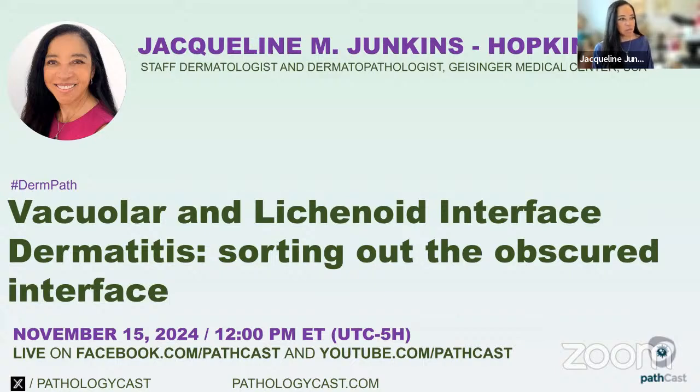So we're going to be talking about vacuolar and lichenoid interface dermatitis.